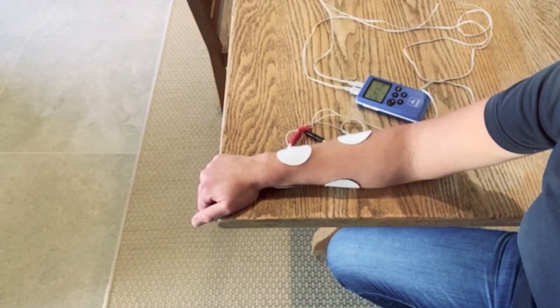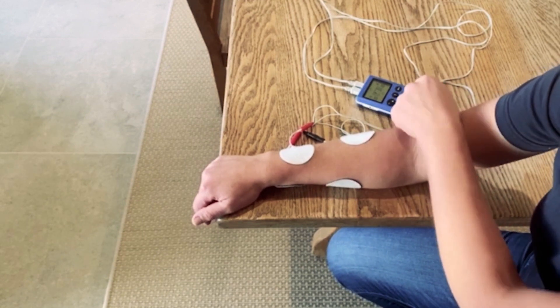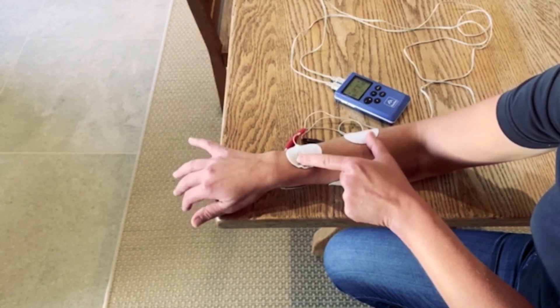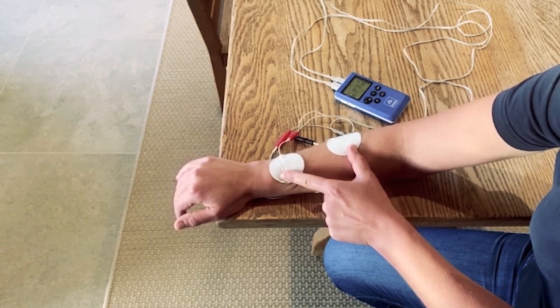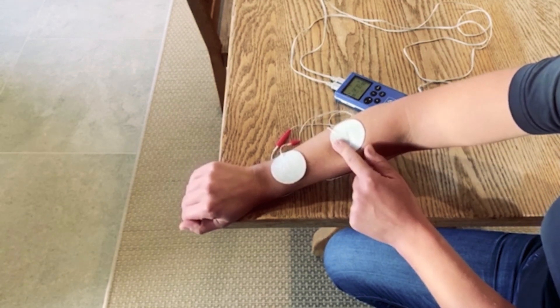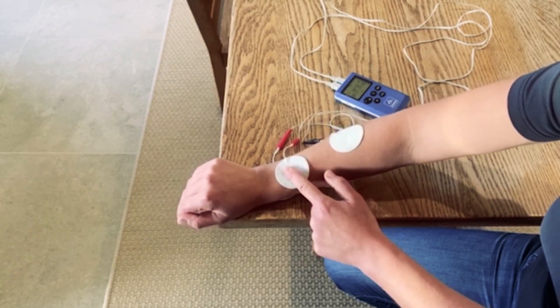Electrode placement for using two channels on an alternating program — so on the Stim Pro Programme 3. Channel A: I've got two electrodes on the wrist and finger extensors. One on the finger extensor motor point, two-thirds of the way up the forearm, and one on the tendinous portion of the forearm.